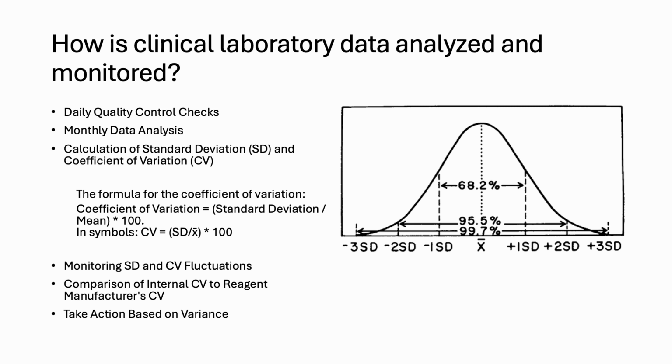Comparison of internal CV to reagent manufacturer CV. Compare the laboratory CV with the CV provided in the reagent or instrument's manual or insert. Consistency between the lab's CV and the manufacturer's CV suggests the testing process is performing as expected.